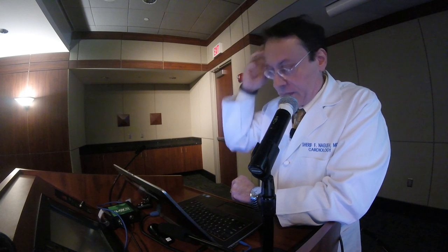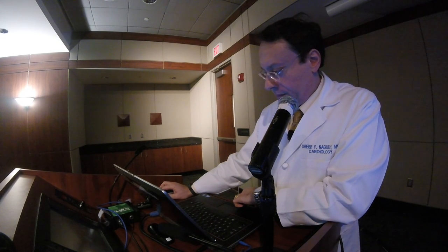The other beautiful group, believe it or not, is from your parasternal views. So, yes, AP diameter. If the AP diameter is small, but the atrium is elongated, this is the limitation. However, if you have a large AP diameter, this is a large enlargement, irrespective. You take it from both long and short axis, and when you're looking at just below the level, you can see the cross-sectional area of the atrium itself. You're not looking at the longitudinal dimension.